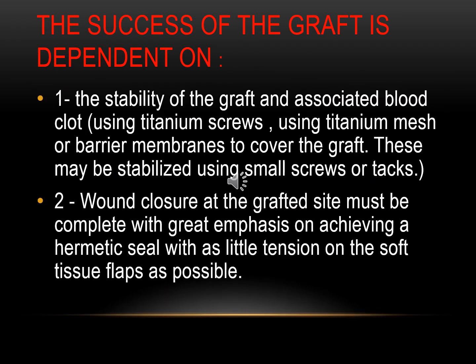The success of the graft procedure is dependent on the following. First, the stability of the graft and associated blood clot. We should fix the bone graft in place without any movement during the healing period, the bone formation period. We can use titanium screws or a titanium membrane or titanium mesh or barrier membrane to cover the graft.